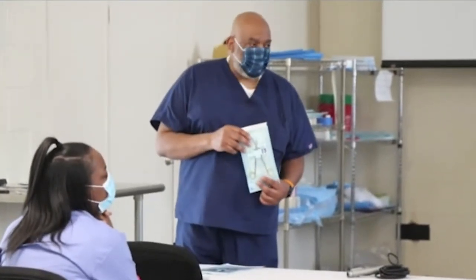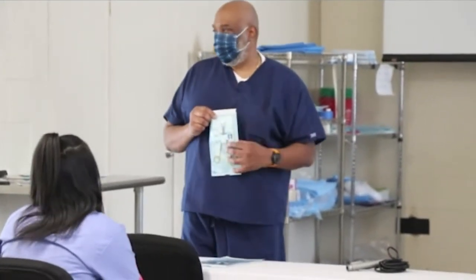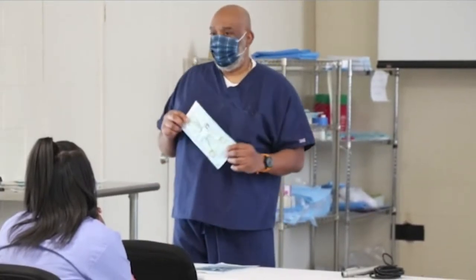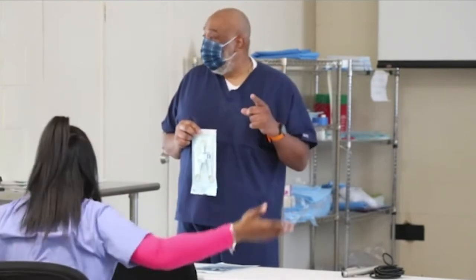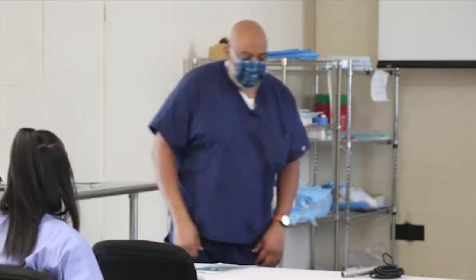Remember, most of the instruments get packaged individually. Now, these peel pack instruments, Renesha, are in pre-sealed envelopes. What happens if I've got an instrument that I need to package and sterilize, and it's too big to go in here? What do I do? I could wrap it or heat sealer. So where's the heat sealer at? So we know that somewhere in the department is a heat sealer. Good. And that's what it's used for.